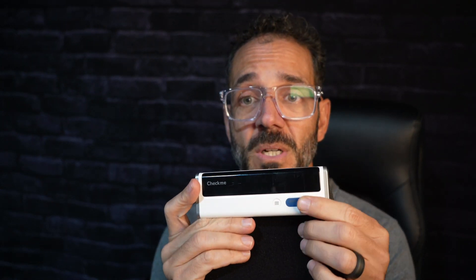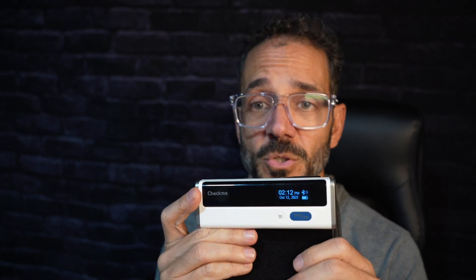It's extremely easy to use. One single button turns it on, and the next push of the button the blood pressure cuff will start going off and give you your blood pressure reading.